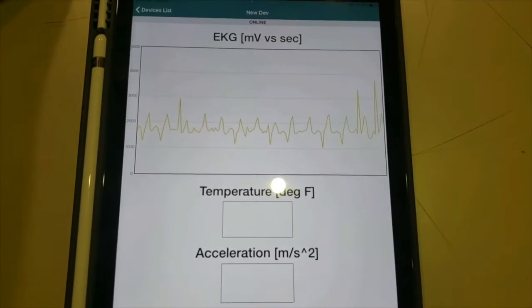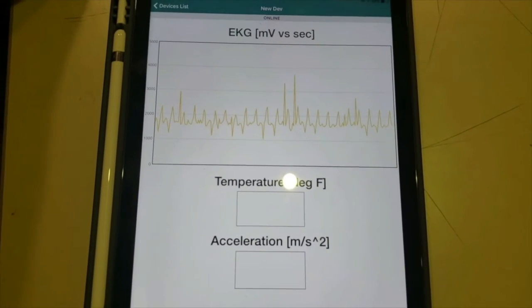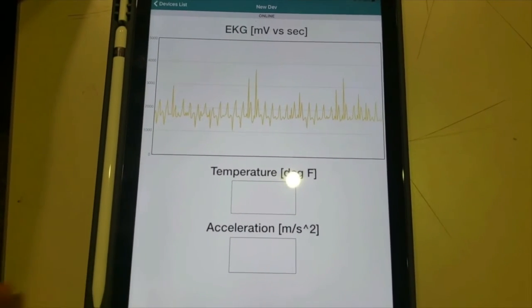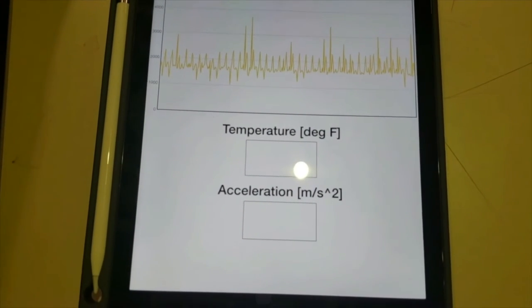As you can see, data has now started to show up on our app. There is a slight delay at the beginning, but everything goes well. We also have space for our temperature sensor and accelerometer data, so once we are able to get those sensors working, we can also transmit that data using our microprocessor.